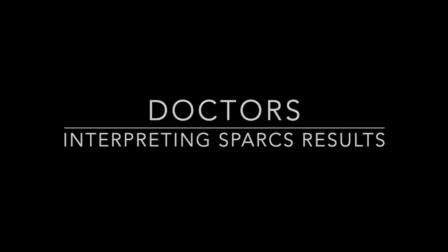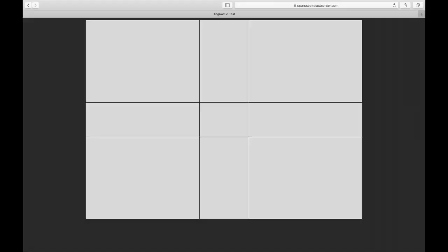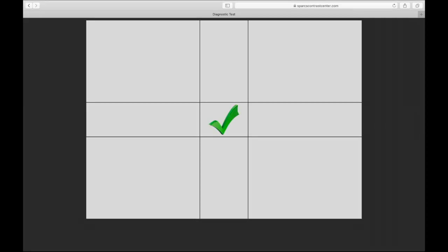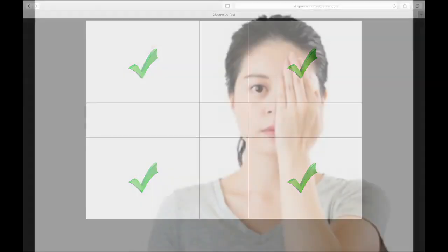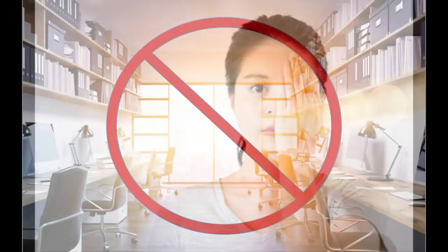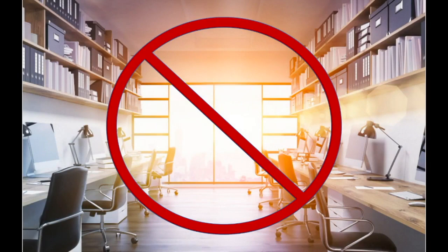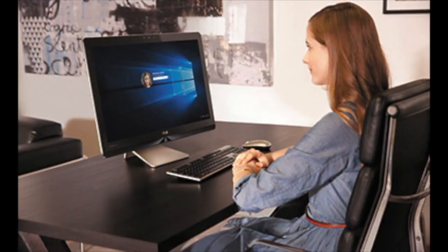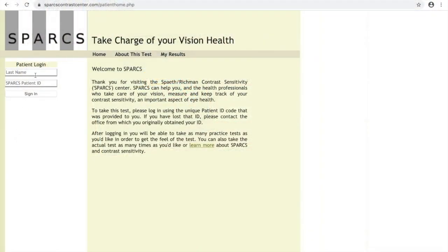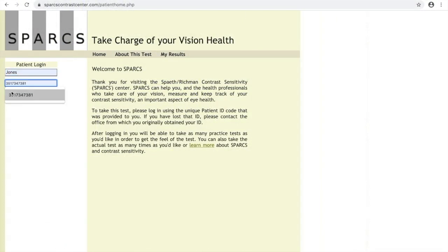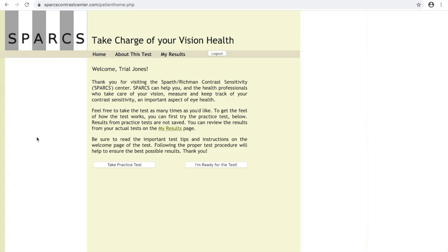Let's go over how SPARCS works and how to interpret the results. The test itself establishes a patient's contrast sensitivity both centrally and peripherally. The test is performed one eye at a time and there should be normal lighting in the room without glare. Patients should take SPARCS in as similar surroundings as possible each time so that their results can be compared over time. After a patient logs in with the ID number you gave them, they can either take a practice test or go right to the real test. If it's their first time, I'd encourage patients to take the practice test as most patients have a slight learning curve with taking SPARCS.